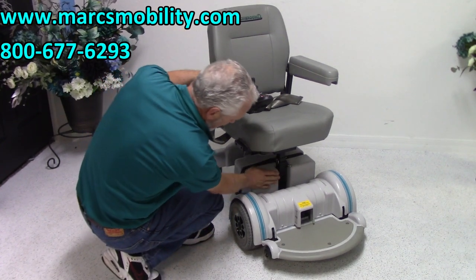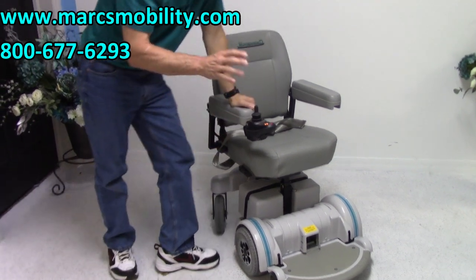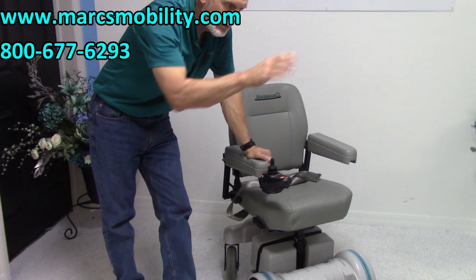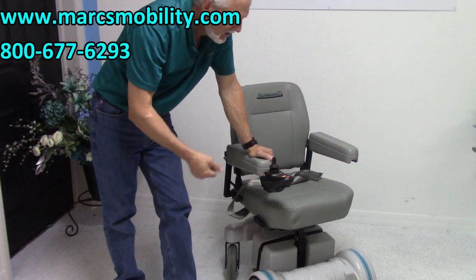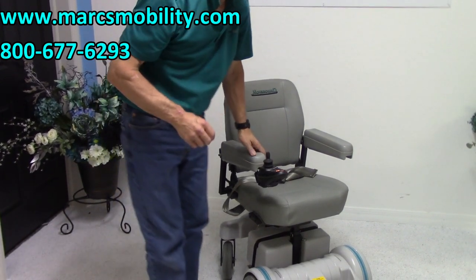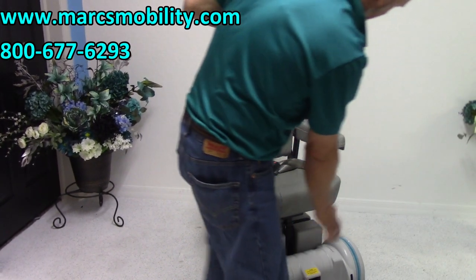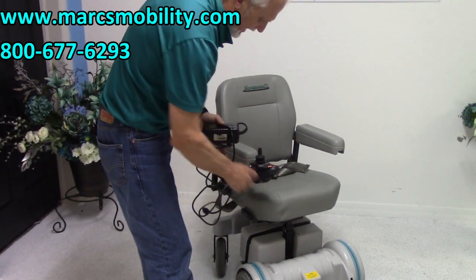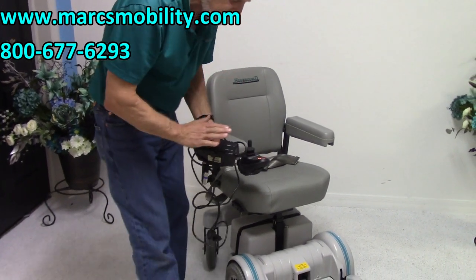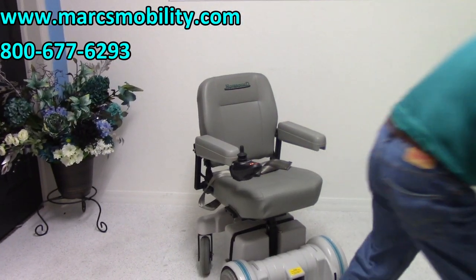You have two batteries — one here and one here. This chair will get about 15 miles on a battery charge. That all depends on conditions; if you're going uphill or in the grass, you may get less. But 15 miles is a long ways. When you charge the battery, you take your charger, plug it right below the joystick, and once the light turns green, you're fully charged. The charger will stop charging automatically once the batteries are full, so you don't have to worry about overcharging.